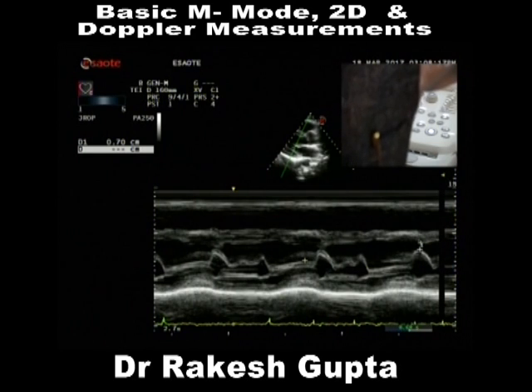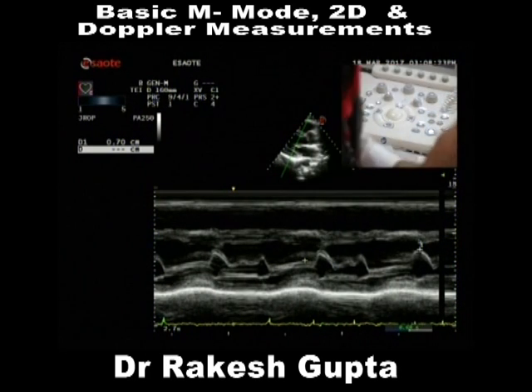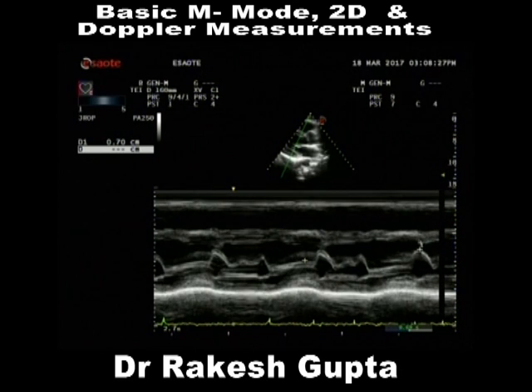Let us say 7 millimeters. Pardon? 7, I believe 7, sir? 7 centimeters, 0.7 centimeters or 7 millimeters. If it becomes larger, it shows two important things. One, LV is dilated, second is poor ejection fraction.